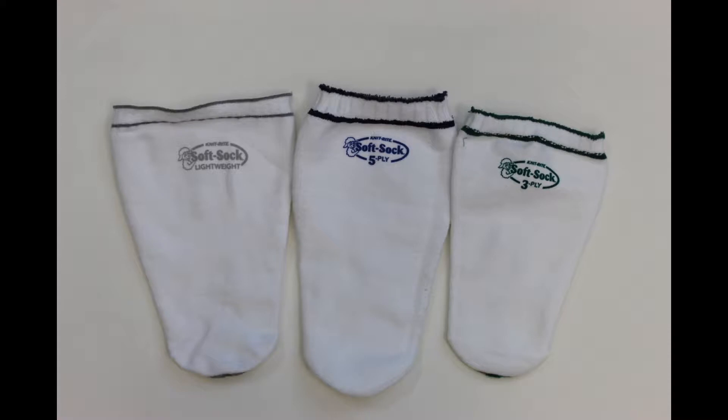Prosthetic socks are a critical component of pin locking prosthetic systems. The socks come in three different thicknesses referred to as one ply, three ply, and five ply. These socks are designed to help you maintain a proper socket fit.